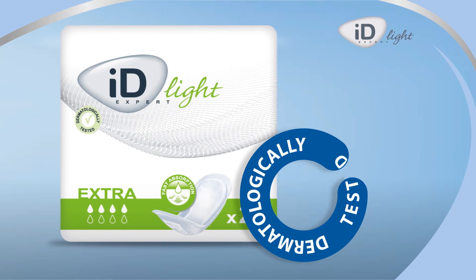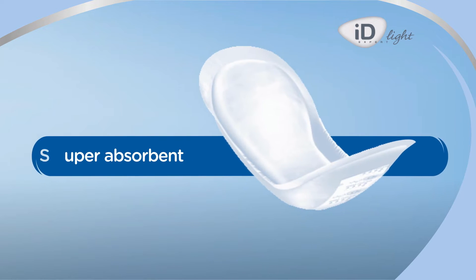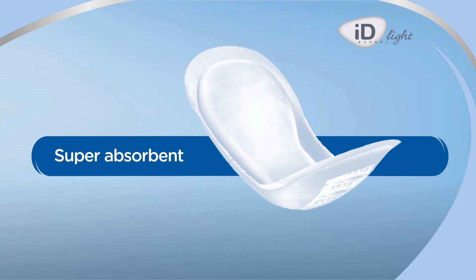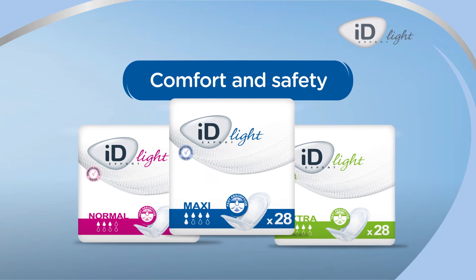The ID Expert Light Range has been designed to address mild incontinence problems. This range of products ensures comfort and discretion thanks to its anatomical shape. The pad should be properly positioned to ensure comfort and safety for the user.